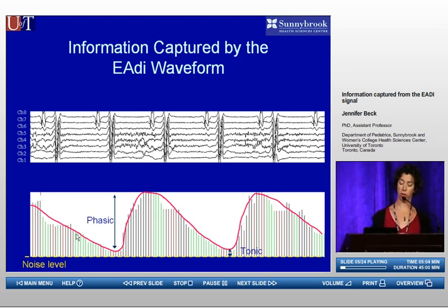Also, usually the signal goes back down to 0, for example, in most adults. And the tracings Christer showed this morning show that the signal increases, it decreases, and then there's a pause between breaths when the signal returns to baseline. But often what we're finding now in the babies and in the lung injury models we have is the presence of diaphragm activity during expiration, and we call this the tonic activity of the diaphragm.